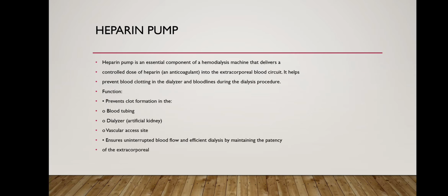Next, we are discussing the heparin pump. The heparin pump is an essential component of the hemodialysis machine that delivers a controlled dose of heparin, an anticoagulant, into the extracorporeal blood circuit. It helps to prevent blood clotting in the dialyzer and blood lines during the dialysis procedure.